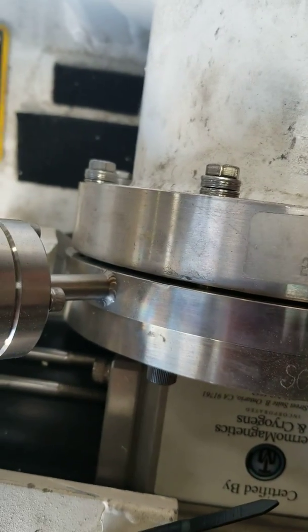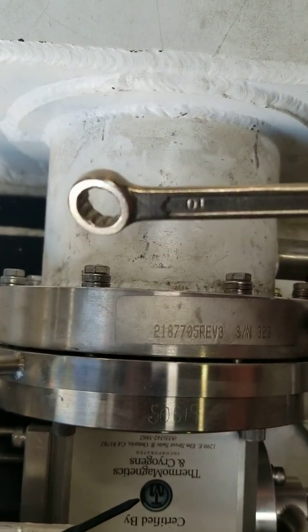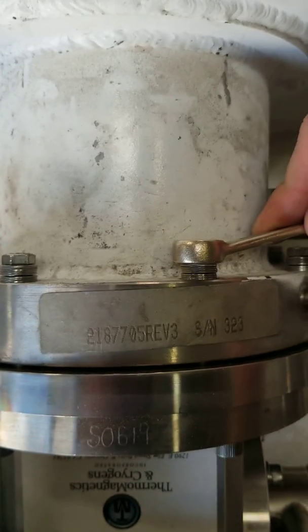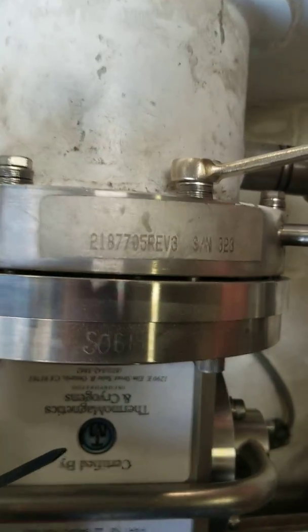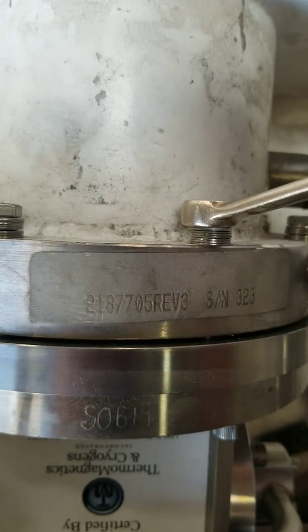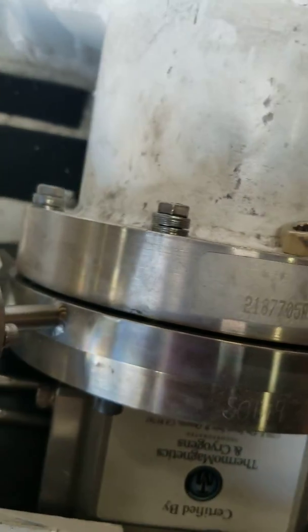It's really important that you don't over tighten them. It's also very important that you tighten in a star pattern. So you'll need a number 10 non-ferrous crescent wrench. You can do it with a ferrous one. You just got to hold on to it tight. And you tighten it until the space goes away. Don't tighten it hard, maybe 15 or 20 foot-pounds. But tighten it until the space goes away.